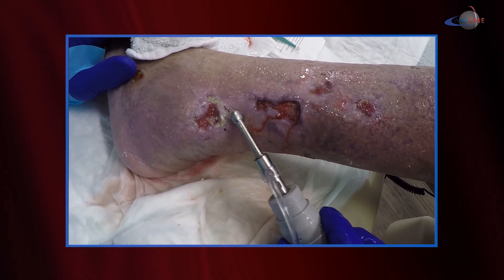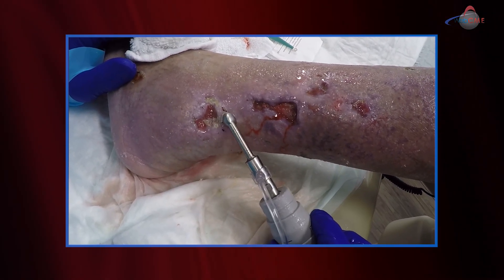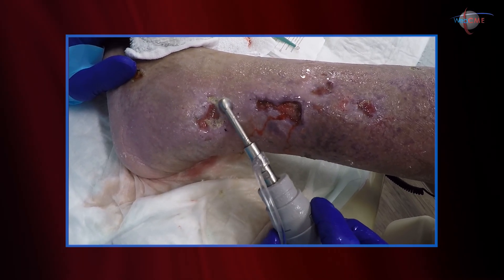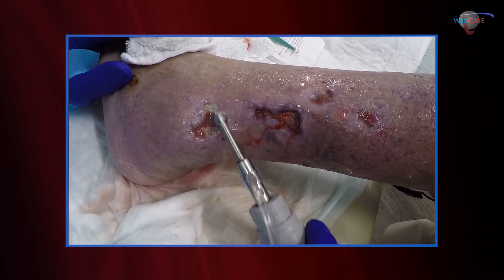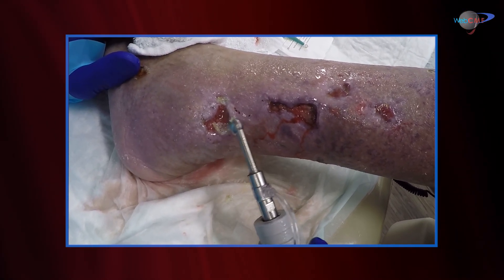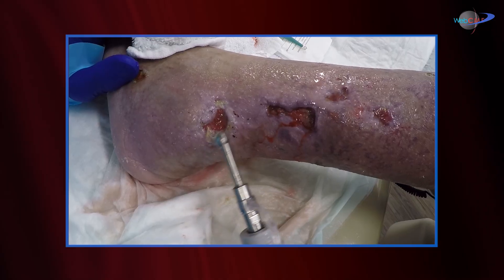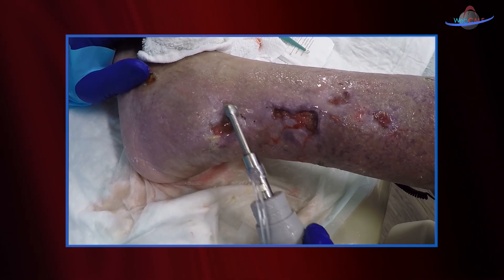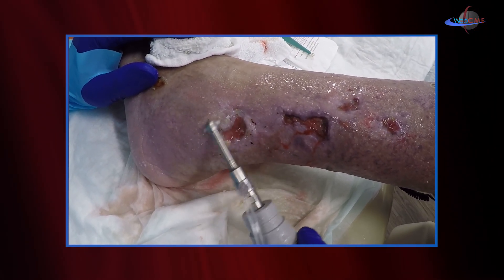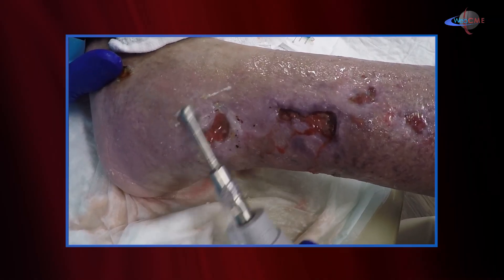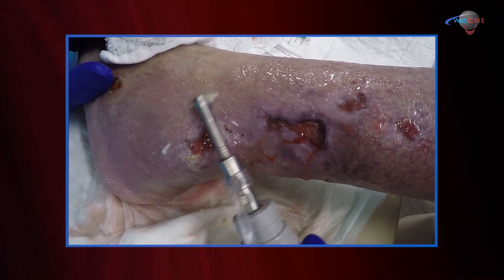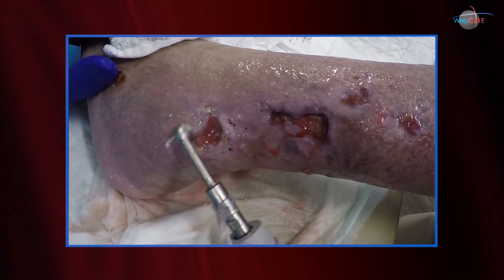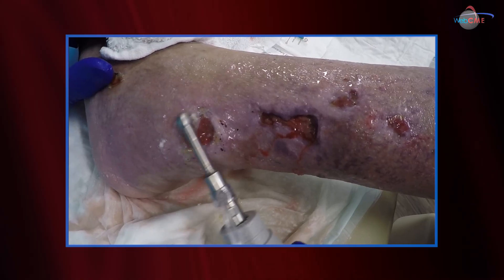Many times during debridement we forget the peri-wound tissues — we forget to clean these margins and edges. I like to clean around the wound just as much as I like to debride the central part of the wound. Ultrasound does a nice job of that.